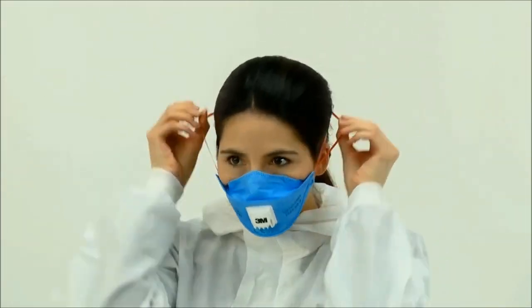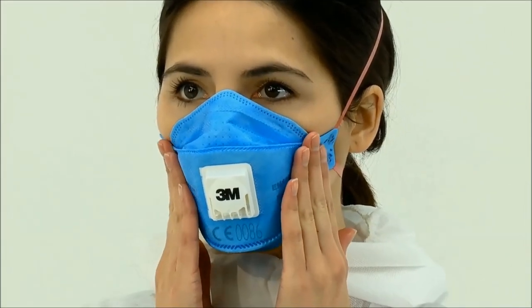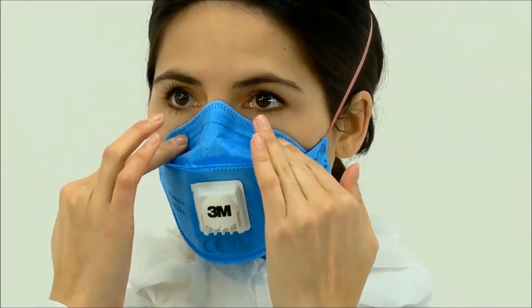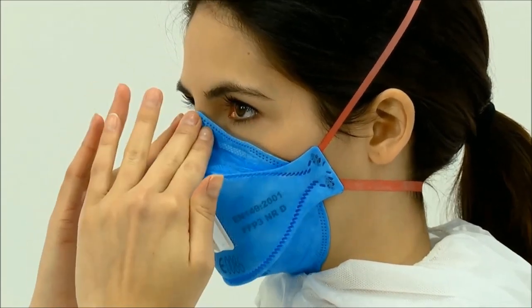A sculpted nose panel offers improved compatibility with eyewear, and an innovative chin tab provides ease of donning and adjustment of the respirator on the face. The 3M Aura disposable respirator provides comfort and style without compromising performance, protecting against dusts and mists found in a wide variety of industrial applications and other work situations requiring FFP3 protection.